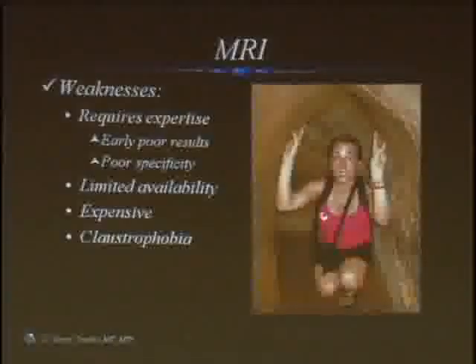Claustrophobia. You hear people all the time say, I want an open bore MRI. There's no such thing as an open bore breast MRI. You have to have a donut. Doesn't matter if it's a big donut or a small donut, but you've got to have a donut and you're going in the tunnel. Nobody does open breast MRI. Nobody. Certainly not here, and certainly not outside of investigation. So claustrophobia is something that you all will deal with in your patients.